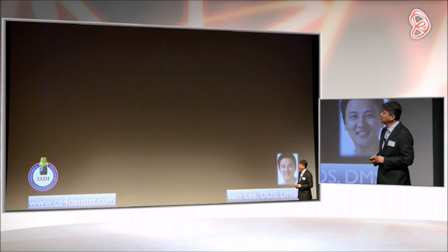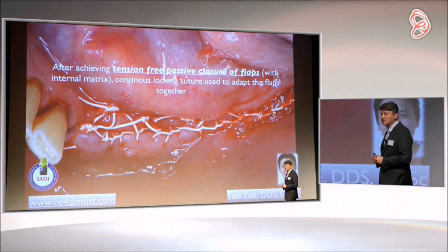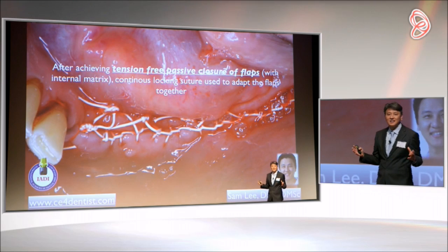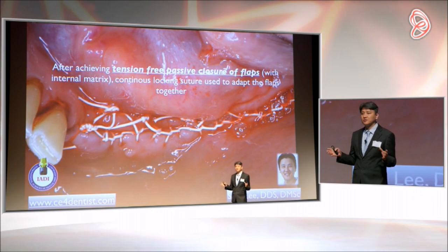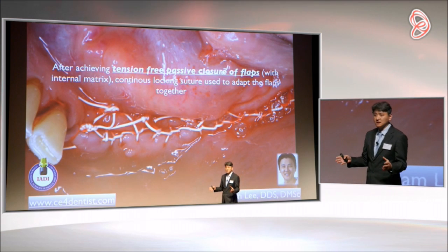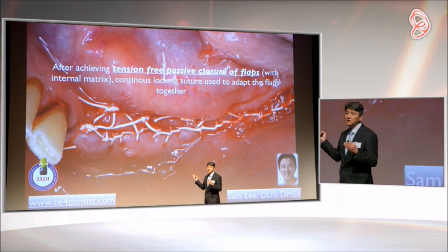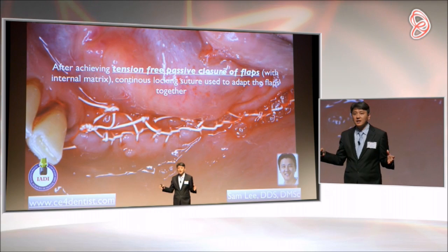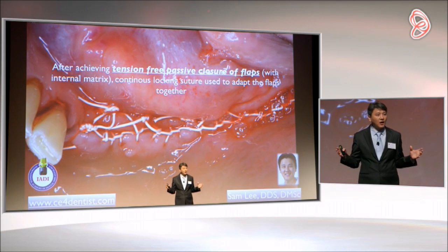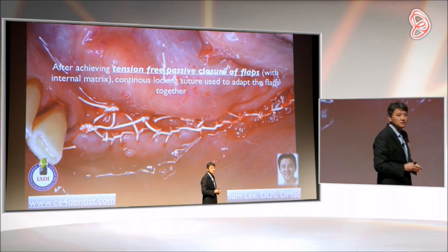So we used to teach all these techniques to our attendees 10 years ago, and it was an exciting field of implant dentistry because 10 years ago, we used to place implants where the bone was. Then we had this great technique called bone grafting, where now we can build bone in any dimension we want with this simple procedure called guided bone regeneration.